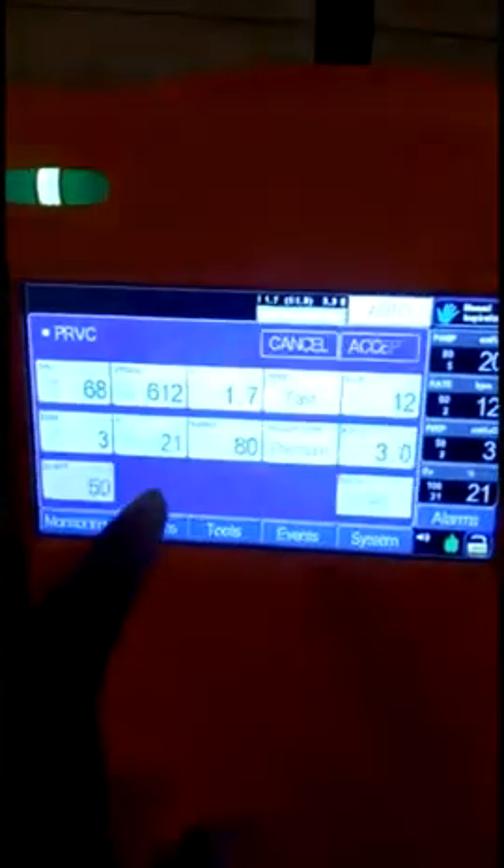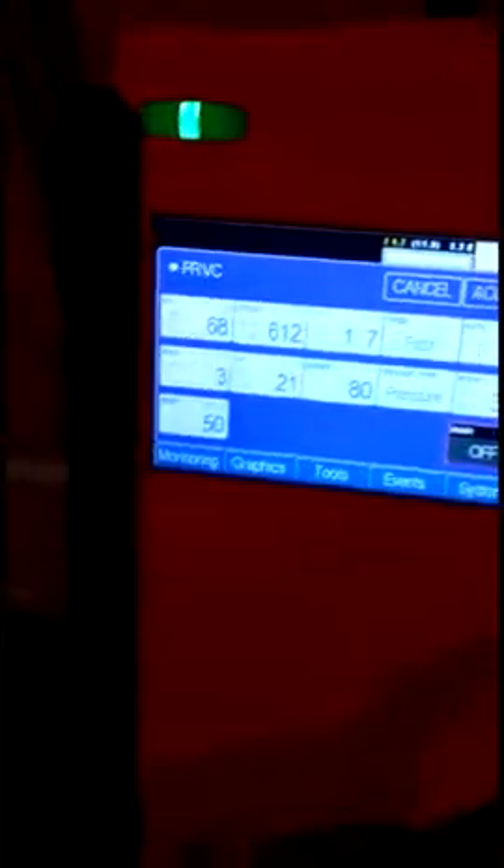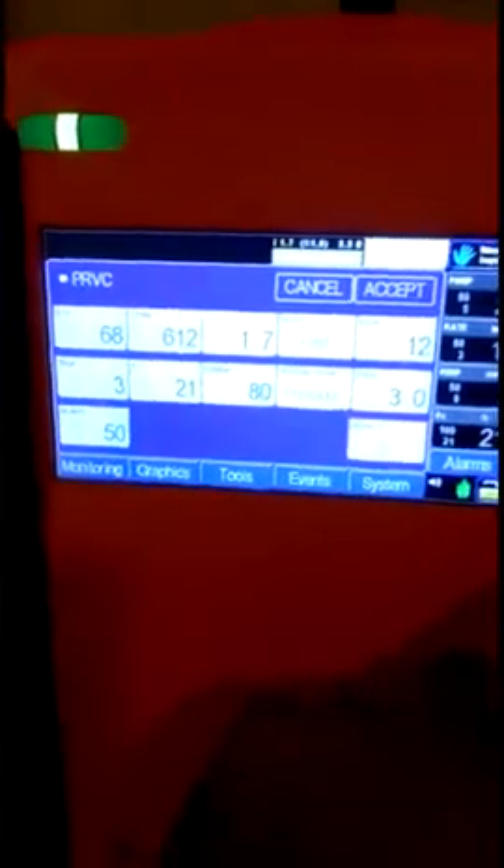For a quick start, you can simply set the patient weight from here and start the ventilator. According to the weight, it will set all the parameters accordingly.